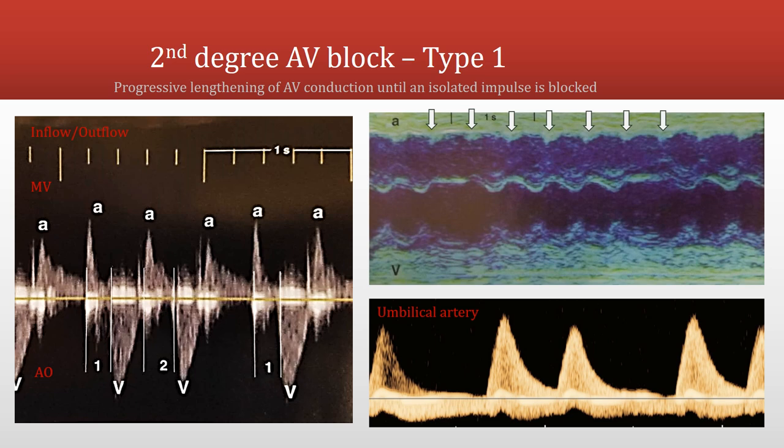In second degree AV block type 1, the AV interval gets progressively longer — the electrical signal takes increasingly longer to pass through the AV node — until it does not get through and a ventricular contraction is missing. On the inflow-outflow image, you can see the first AV interval followed by a longer second AV interval, and then a missing ventricular contraction. On the M-mode image, atrial contractions shown by white arrows at the top are occurring at a regular rate, but ventricular contractions are periodically absent.